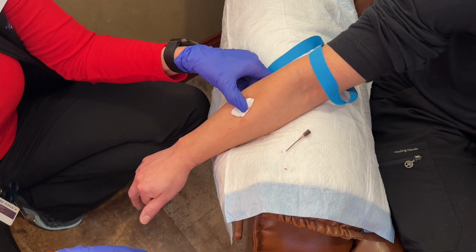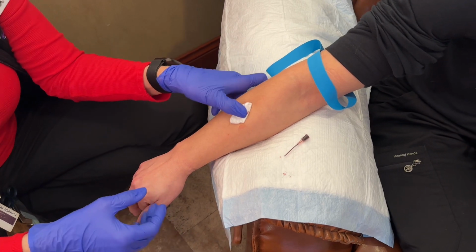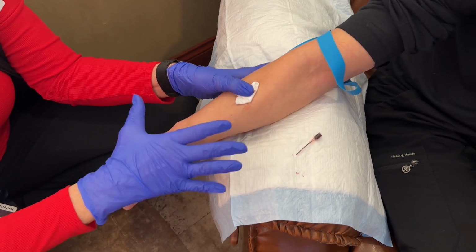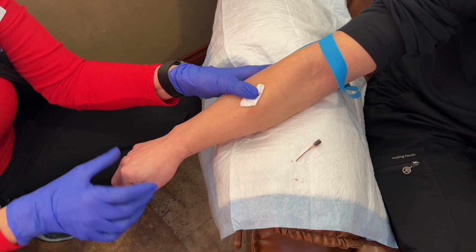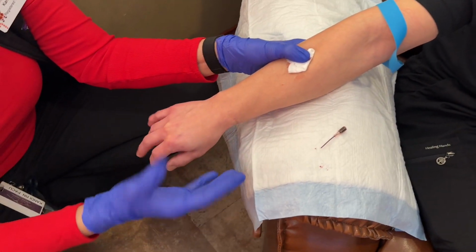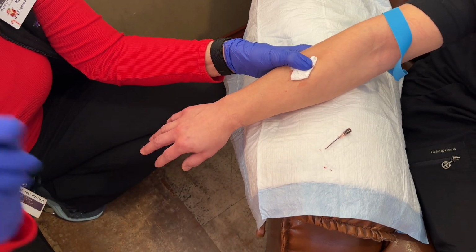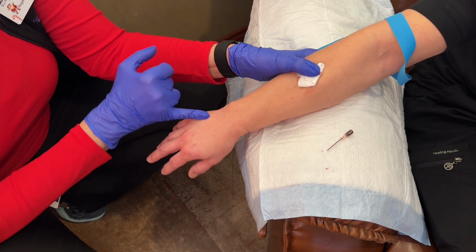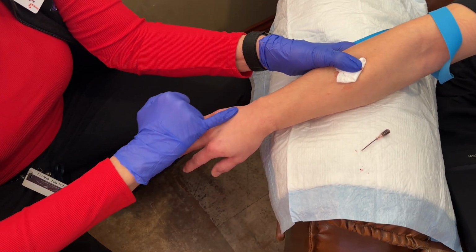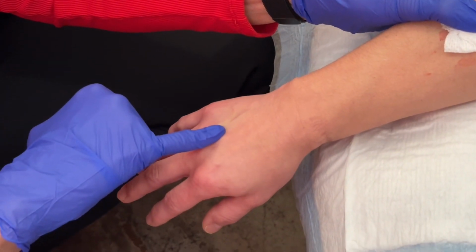Okay. So that was a good vein. Any tips or tricks on veins that aren't popping? The big thing is if you can feel a vein, they're usually pretty good. Hand veins, I'm not a big hand user, as most of you know. The biggest thing is where you go. Some people come in and they're trying to go here. You can see her vein right here in her hand, even though I don't have a tourniquet on. Her vein actually is down here.